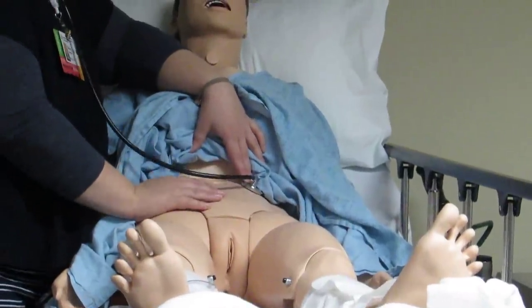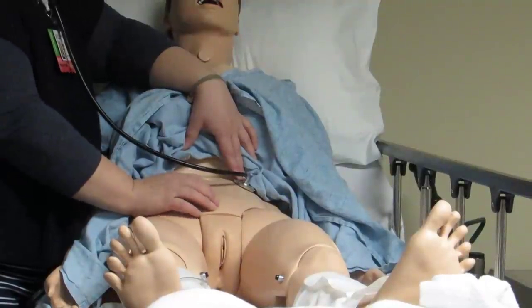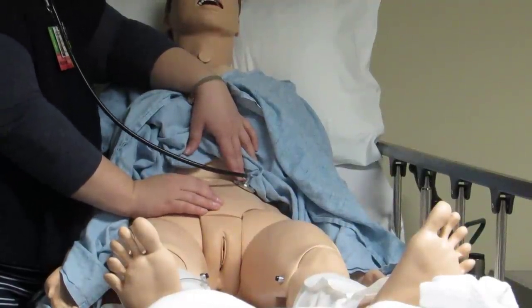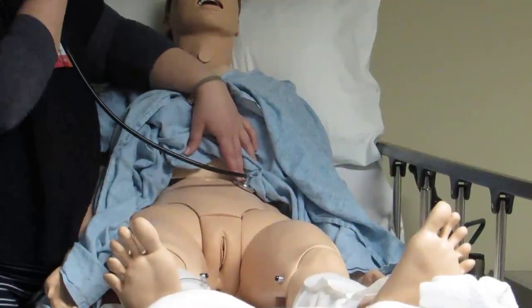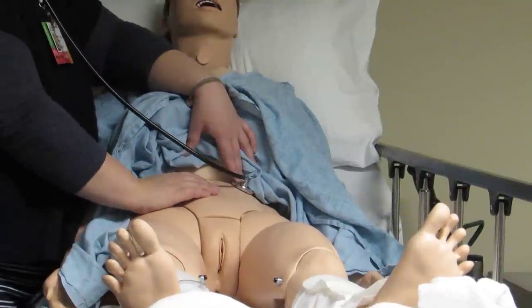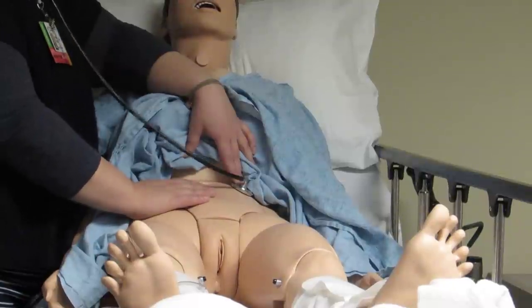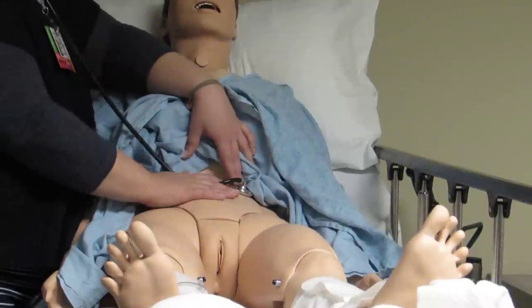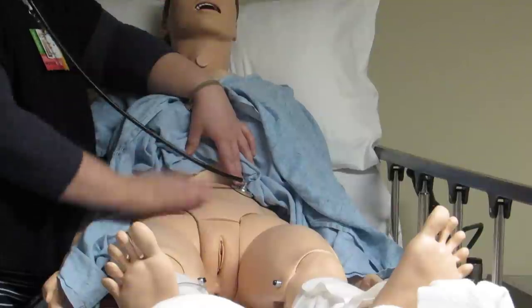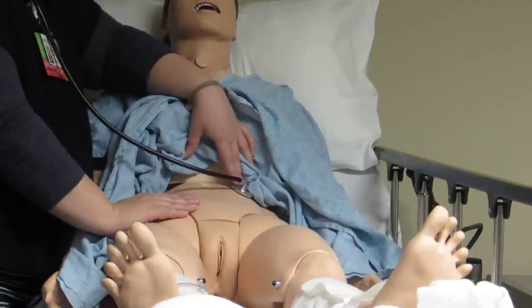I'm going to listen in each quadrant until I hear something. You don't have to listen in each quadrant for a certain amount of time. You just want to listen till you hear something. If it takes you closer to a minute till you hear something, you're going to consider those more hypoactive bowel sounds. Otherwise, you should be hearing something, I would say, within 20 or 30 seconds and fairly regularly. If it's more frequent than that, you put your stethoscope down and it's like gurgle, gurgle, gurgle, nonstop, you're going to consider the patient has hyperactive bowel sounds.